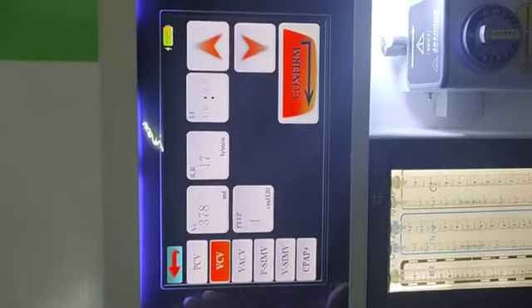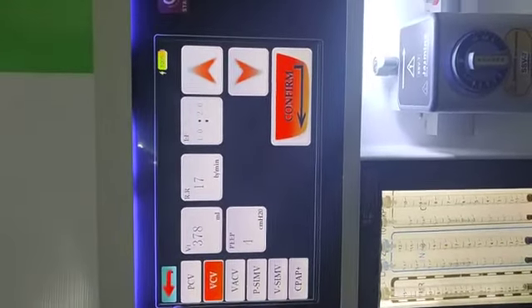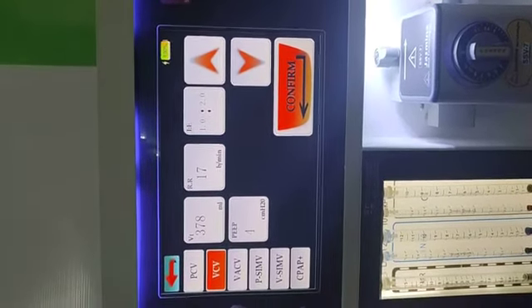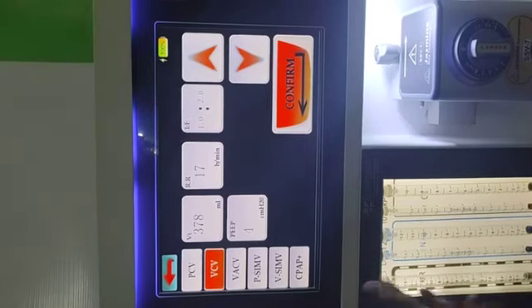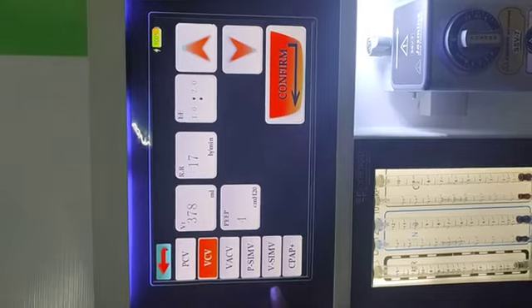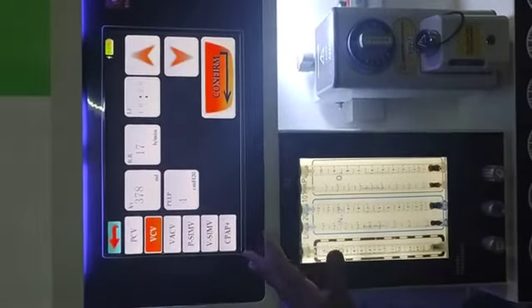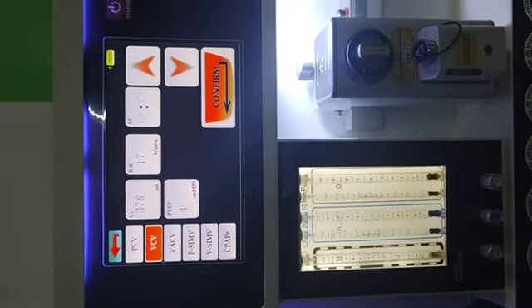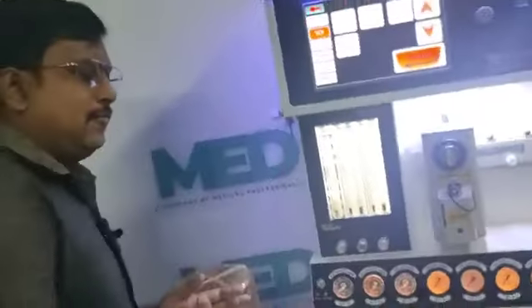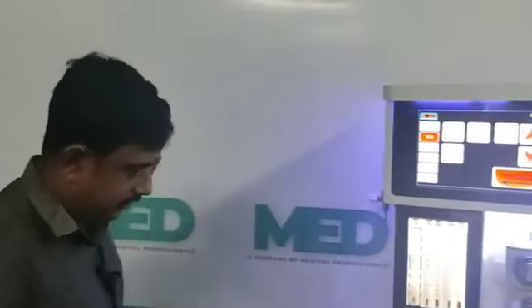Now these are your modes. You have pressure control ventilation and volume control ventilation, which are the mandatory modes. Then you have assist volume control ventilation, so volume control with patient triggering, and you have SIMV pressure or SIMV volume control. So with SIMV, you are either controlling pressure or controlling volume. And then you have CPAP plus, meaning CPAP with apnea backup ventilation.